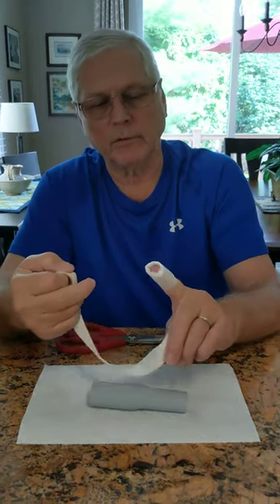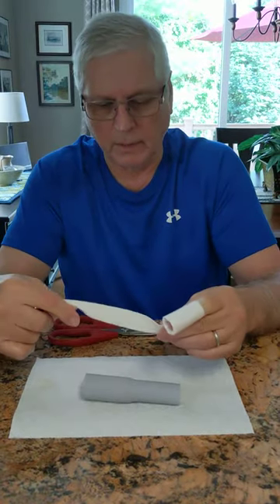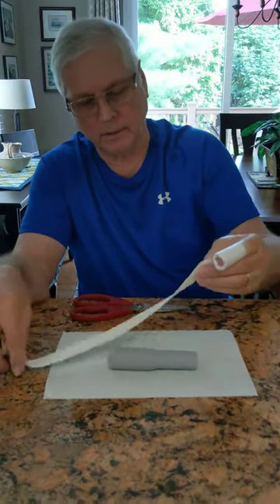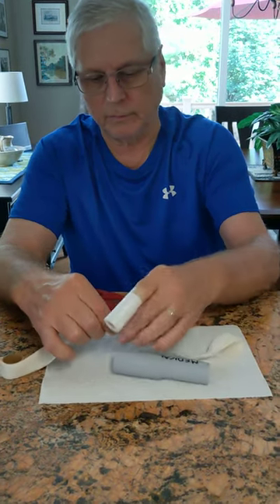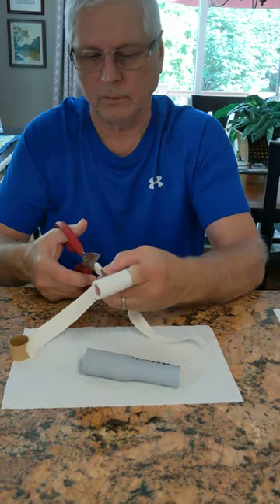So now that I have my dressing on the wound — I didn't want to show it to you — this tube is five inches long, this piece of conduit, and this gauze. I use two lengths of this to do my finger. Of course, they make different sizes of this tube, this gauze tube.